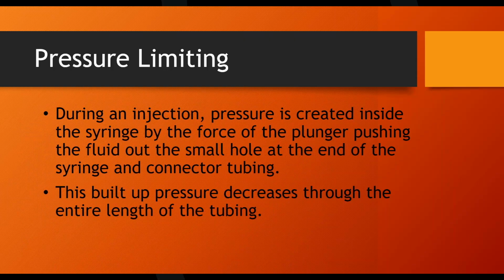Now, once my syringes have fluid in them, we have to connect the injector to the patient, and that's what this tubing is for. It's longer and it's coiled. One connector goes to the contrast side, the other connector goes to the saline side, and then this tube here is what goes to the patient, the IV needle, wherever the IV needle may be. All right. Now, when we do an injection, what do I got? 5 and 20.